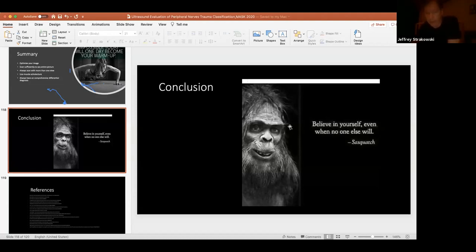Well, that's a wide array of potential problems. A nutritional neuropathy may or may not have enlargements, and the things you would see in that situation would be very nonspecific for the most part. You wouldn't necessarily see focal changes anywhere unless, if you have a metabolically challenged nerve, the nerves can get affected in places where they get trapped more potentially too. So your role in trying to identify that is to look at general enlargement versus the general population. You wouldn't generally see a lot of fascicular changes. You would instead see some enlargement, but that's a very nonspecific finding that hasn't been terribly studied.